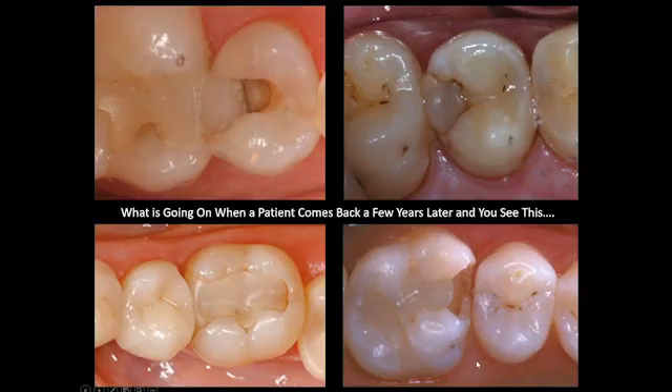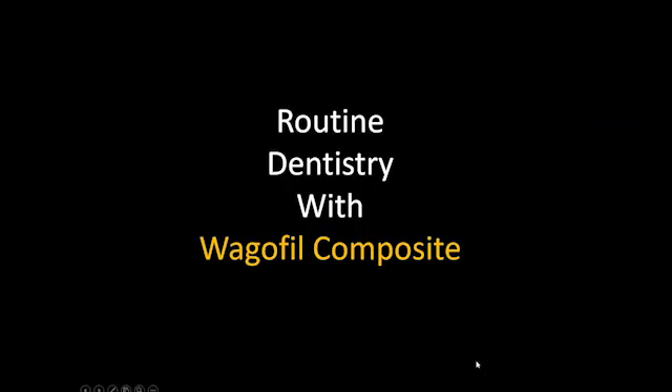These are the types of images we don't want to see when our patients come back. So let's take a look at some routine dentistry we do every day within our practice using this new material called Wago Fill. Wago Fill is a micro hybrid type of composite that is infused not only with silica but also with zirconia particles, and what these zirconia particles allow you to get is more strength.